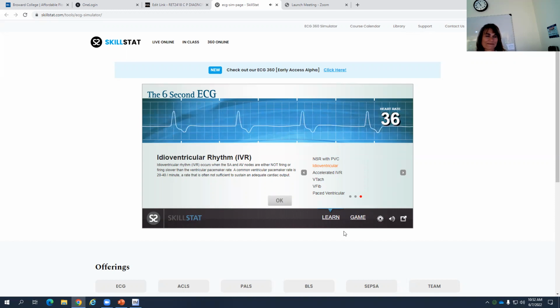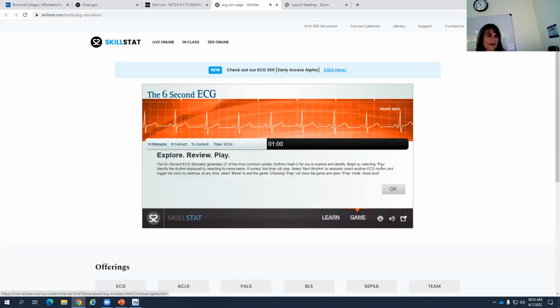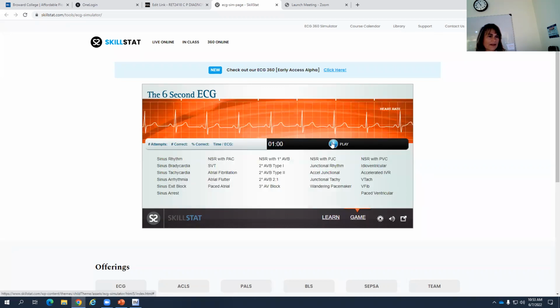Have we seen the sinus exit block yet? Let's see. No, we haven't. So sinus exit block, sinus arrest, they look the same. You just get this big long pause. Oh, look, it stops. Also when it's in words. It doesn't work when you're playing the game.